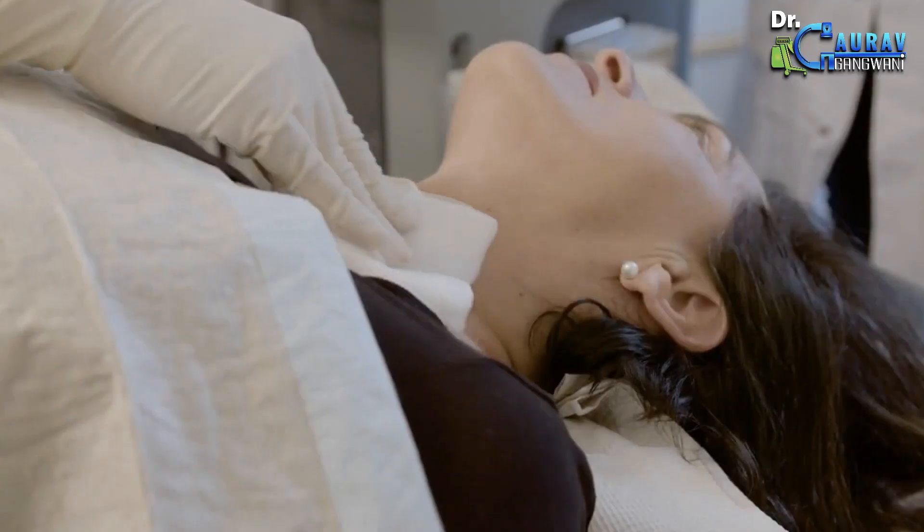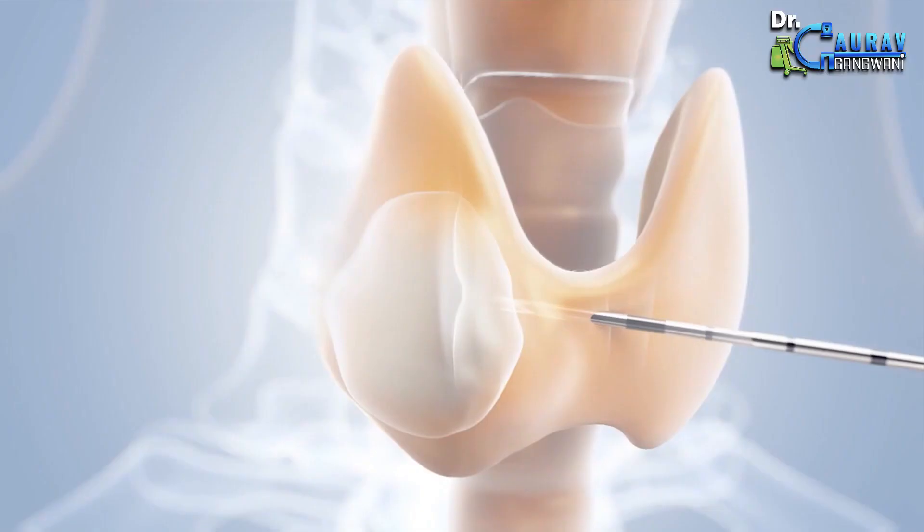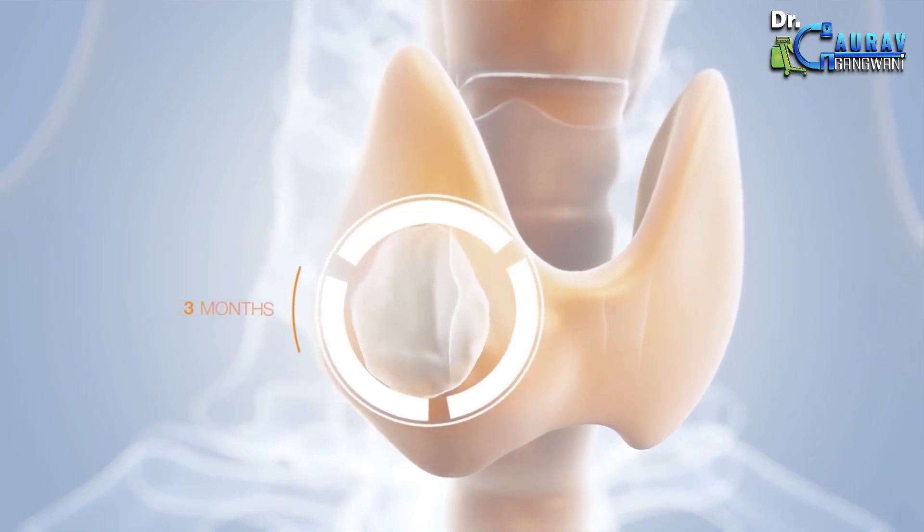The nodule has completely disappeared. Once the operation is over, you won't feel any change immediately. But the nodule is now completely dead tissue without any blood supply and no single live cell. Over time it will shrink, with almost 50% to 70% shrinkage in 3 to 6 months and nearly 90% shrinkage in 9 months to a year.